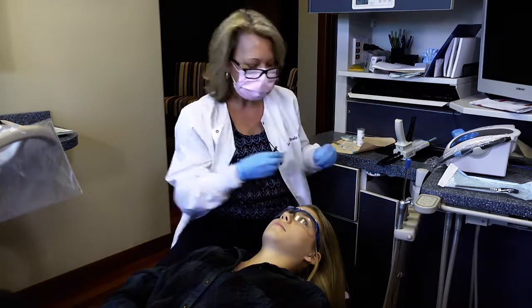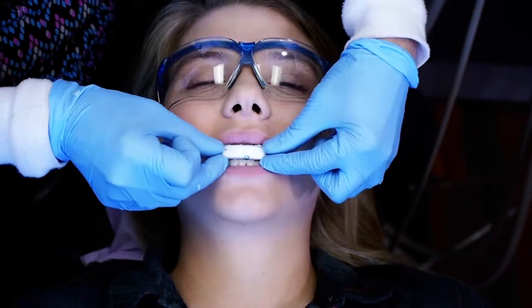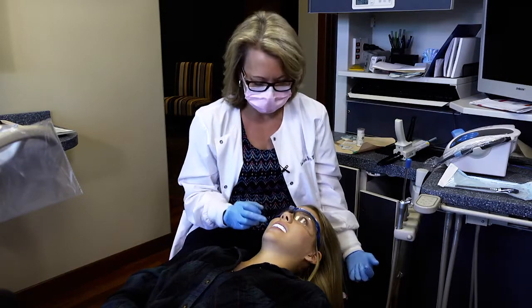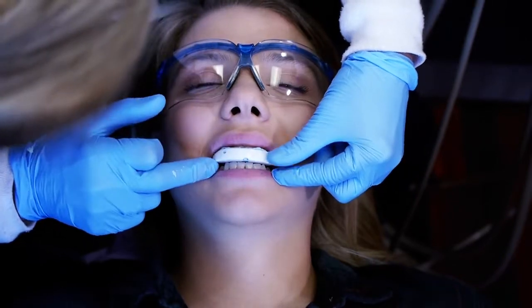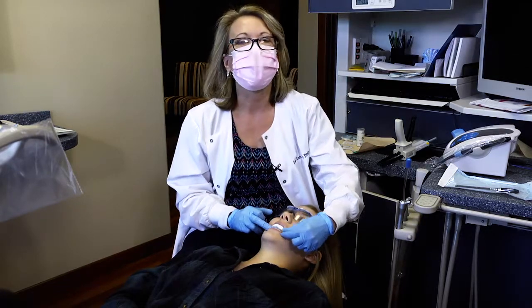Once we have it trimmed, I'm going to take it back in and try it in. And I'm going to make sure that I've got enough retention. I like the fact that when I put it in, I can feel a tiny little snap where the bite registration is locking in a little bit over Jenna's teeth. And I can have her bite again for me, and I can verify that I do have contact on both of her canine cusp tips, but none of her back teeth are touching.